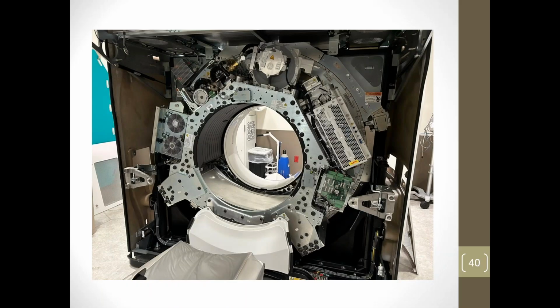And so here's the inside of a CT scan. This is one of GE's newest ones. Up here is your X-ray tube. And down here is a big bore system. And this is your giant detector. This is probably about twice the size of your conventional CT scanner. So they can do all kinds of really cool scans with this.